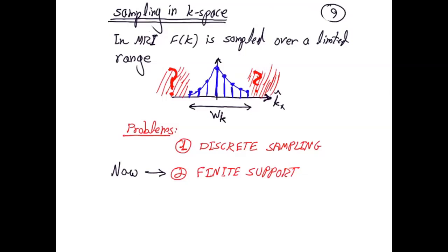And then you prescribe graphically, you can have a graphical prescription where you say, I'm going to put that size of a window, and you can see how it overlaps with the anatomy. And you can really prescribe it up to the millimeter if you want to. And sometimes if there is a really good technician, they would let the nose, for example, overlap with the bone of the back of the head, right? Or with the back of the neck where you have a curvature, that still allows you to reduce the scan time by 10%, for somebody that has a big nose.